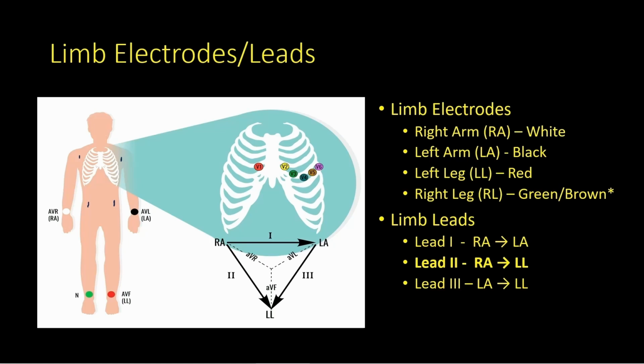If you're going to put this electrode on the shoulder, you have to put this one there. You wouldn't want to put it down here. At the same token, if you're going to put this one on the shoulder, you're not going to want to put the other one down here. Again, building this, what we call Einthoven's triangle, will give us the best picture of what's going on with the patient's heart and the most reliable tracings.